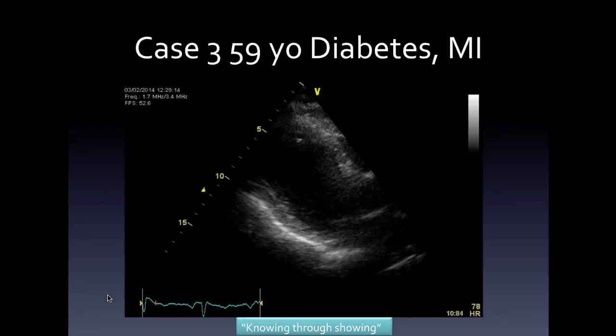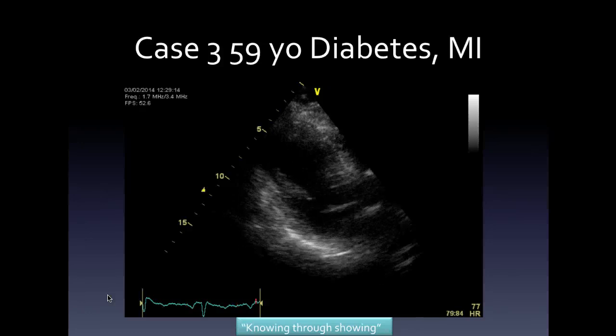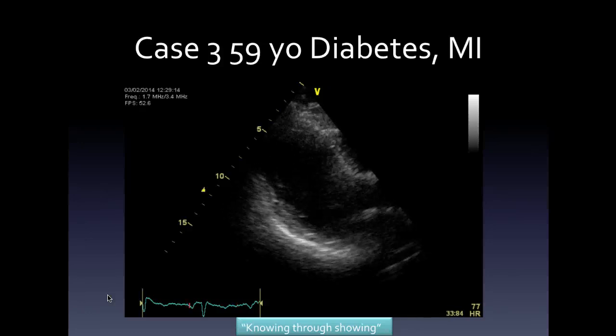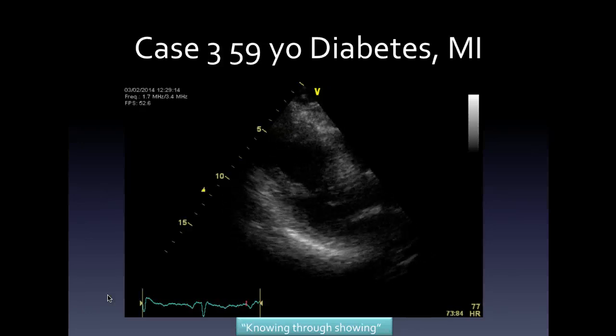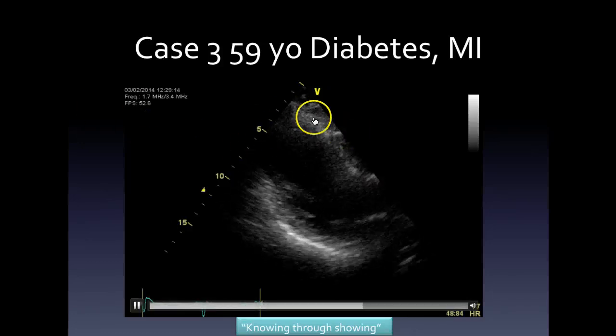Okay, I wouldn't have found this hard. But if you merely took one shot in the intensive care setting, because of what I told you, and even though we're not meant to look at the apex, you do get a sense that the apex isn't happy, even though you're not meant to comment on the apex.